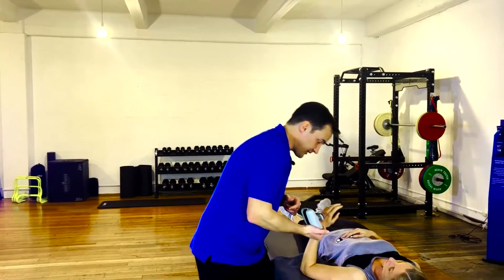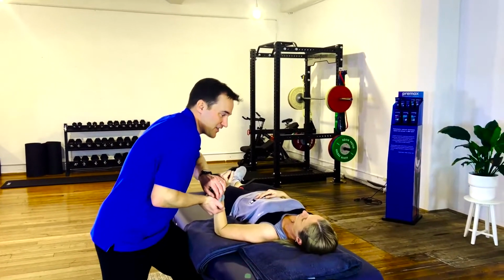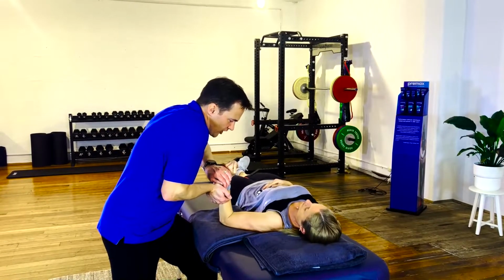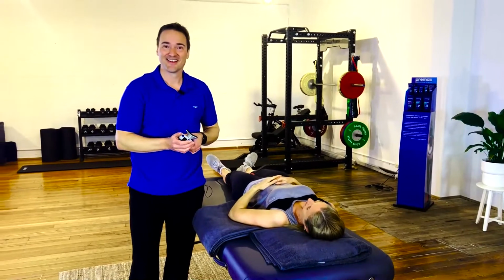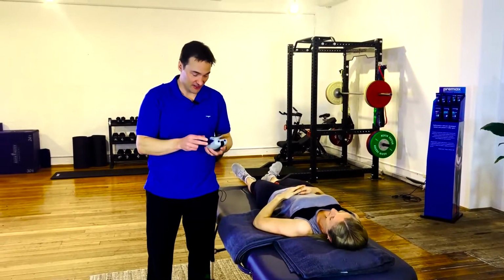Let's go again. Number 3, you've got to beat 10.1 kilograms. So we're introducing some feedback and motivation and patient engagement here. Ready, Susanna? Okay, 3, 2, 1, build it up and push, push, come on, go, go, push, push, push, good, good, good, push. 10.1 kilograms. She knows how to get out of the 4th test, like the cricket teams.